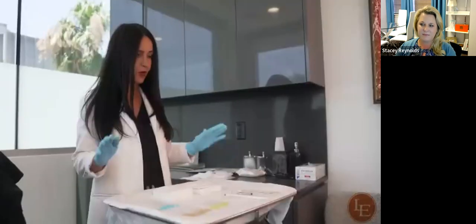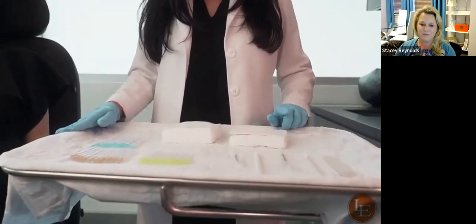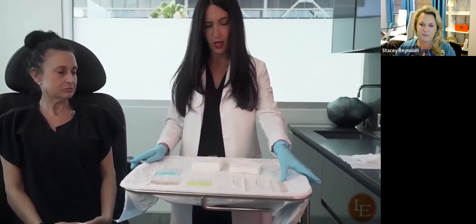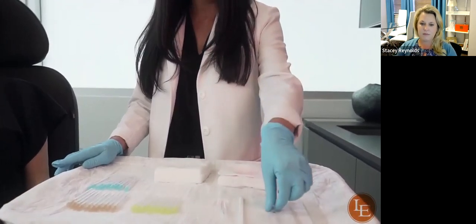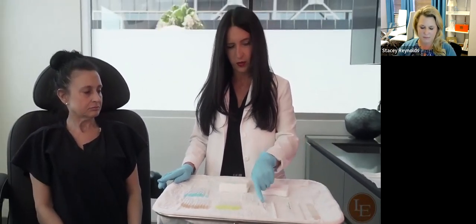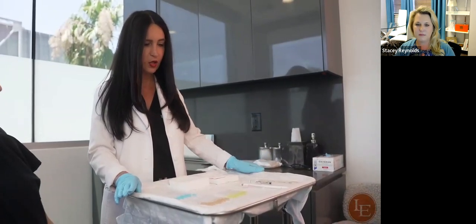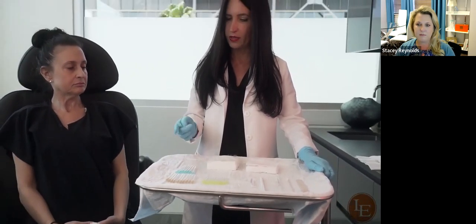This is a basic tray setup: a clean environment, antiseptic such as Hibiclens and alcohol, non-woven gauze, a tongue depressor for applying topical numbing, a 1ml syringe with a 32-gauge needle containing straight lido with epi for the entry point, an 18-gauge needle to make the port, a white eyeliner or dry erase marker to draw vectors, and the threads to be used. Pre-release the caps ahead of time so they're easier to grab and insert.